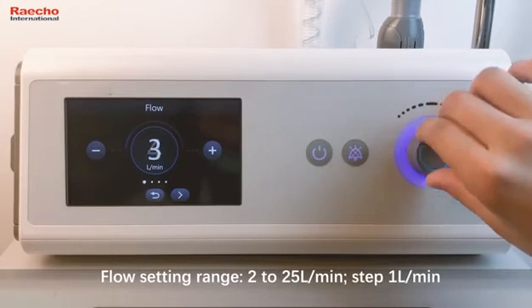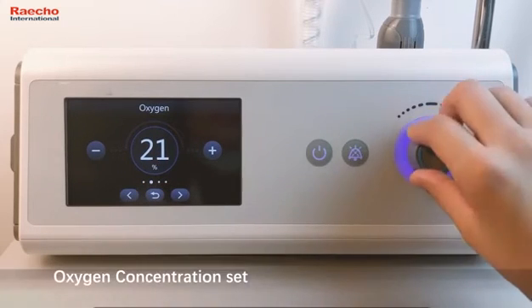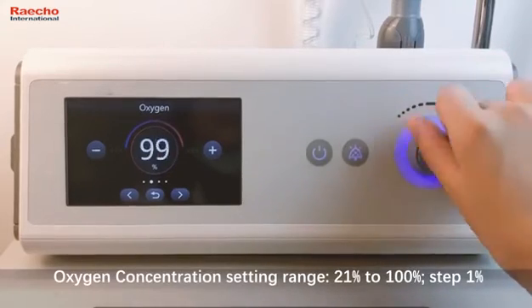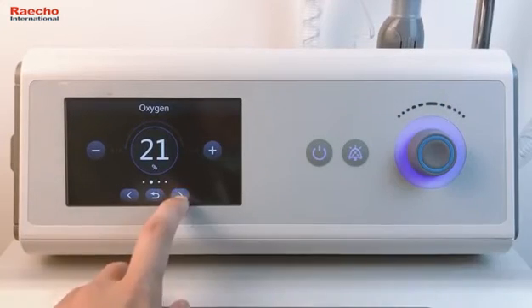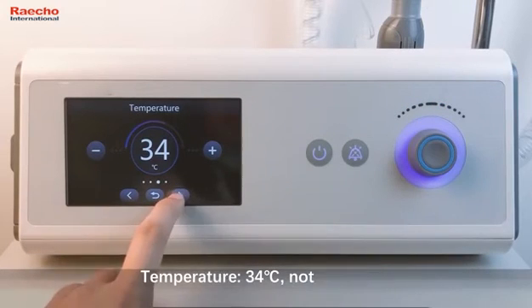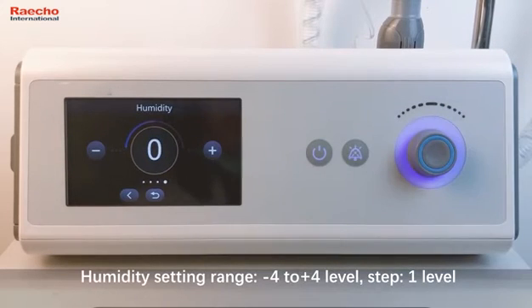Flow setting range 2 to 25 liters per minute. Step 1 liter per minute. Oxygen concentration setting range 21% to 100%. Step 1%. Temperature 34 degrees, not adjustable. Humidity setting range -4 to 4 level. Step 1 level.